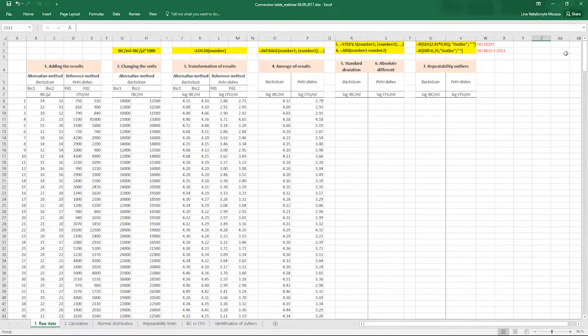We see many outliers due to repeatability errors, especially on Petri dishes, on the reference method, where many factors such as slightly different incubation conditions, dilution error, and or human error have impact on repeatability. The repeatability outliers on BactoScan can be due to improper sample handling.